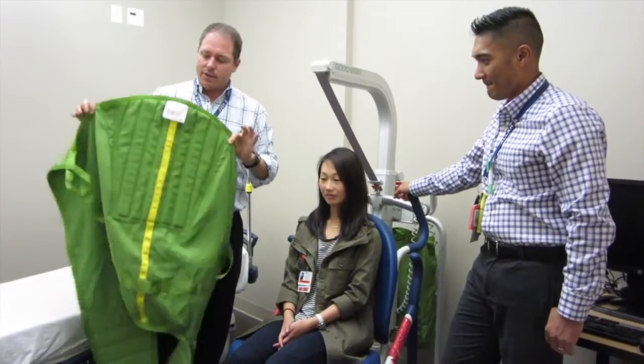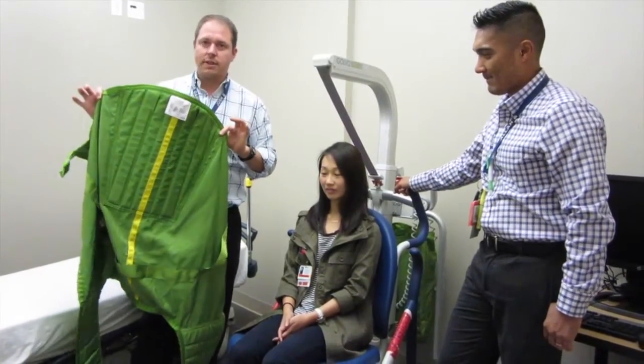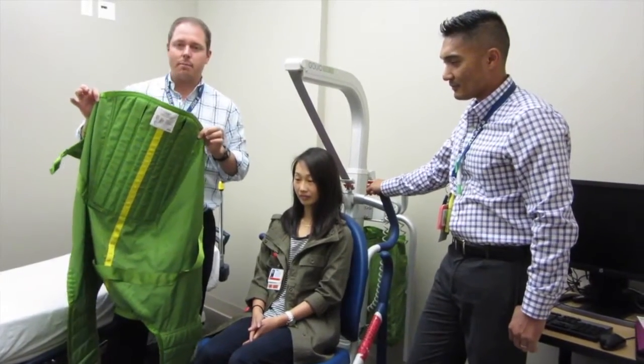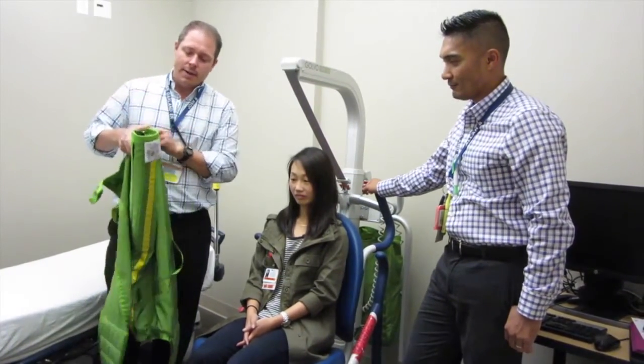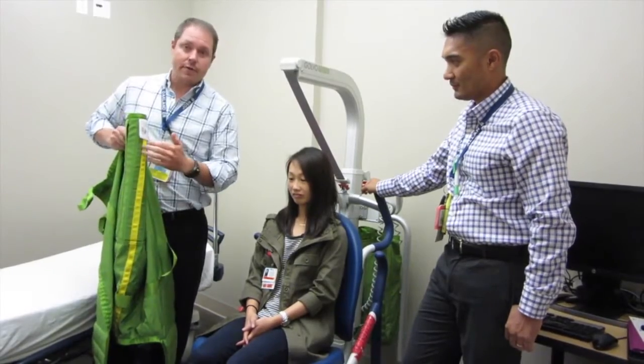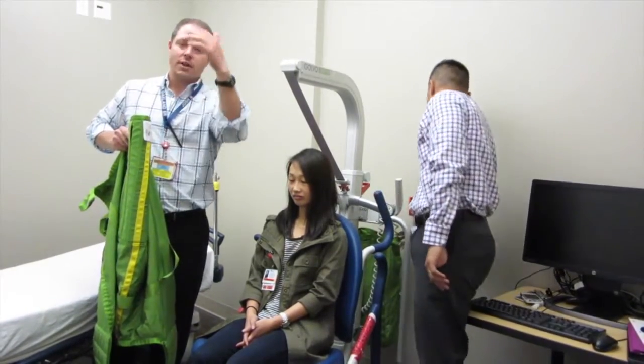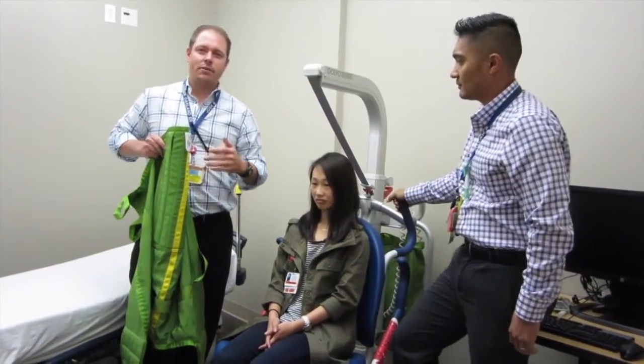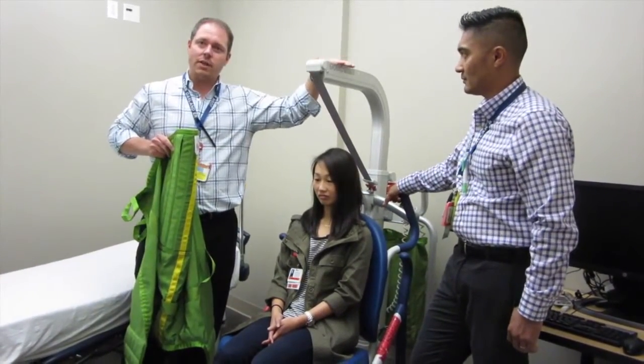The Golvos lift the patients using these disposable slings. These slings go into a special recycling container at the end of each use so they can be processed by our team here. They also have a yellow stripe. They're medium size, black stripe for large, extra large, etc. Each one of these sling sizes will carry a slightly different weight rating, but ultimately it doesn't matter because this guy can still only lift 440.